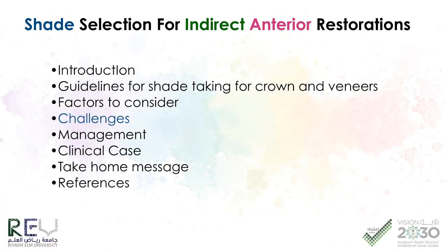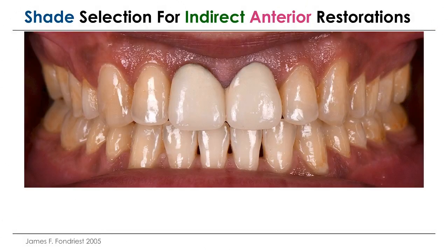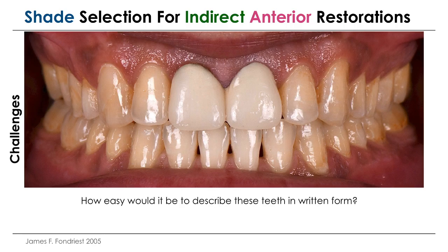What about the challenges that we face when taking shade for restorations? We have to understand how many words we need to describe these teeth in written form. So it's very important that the practitioner develops their written, graphic, and photographic communication, okay?